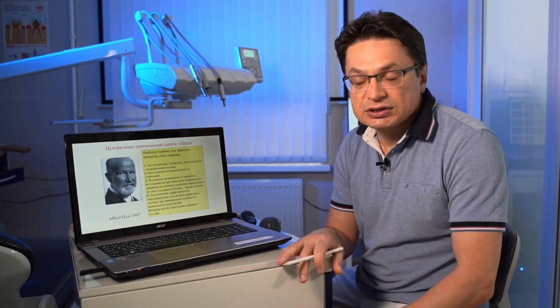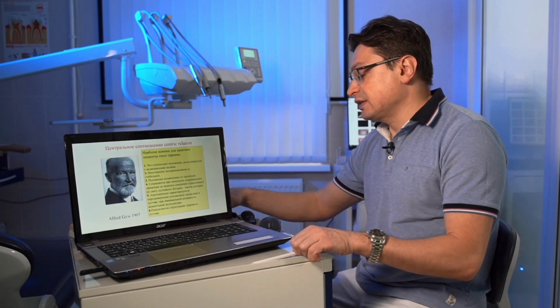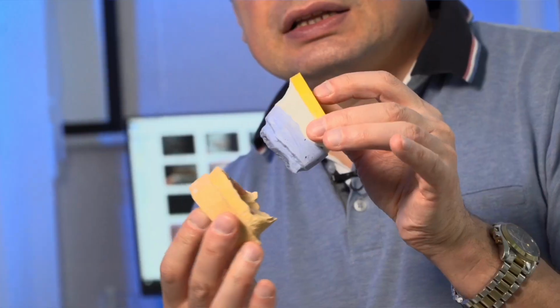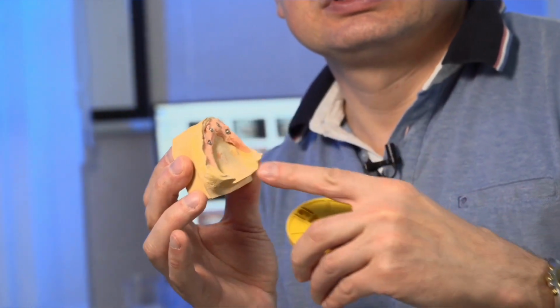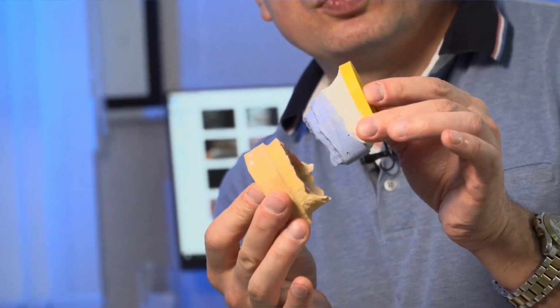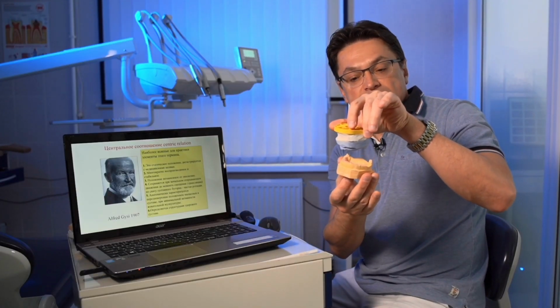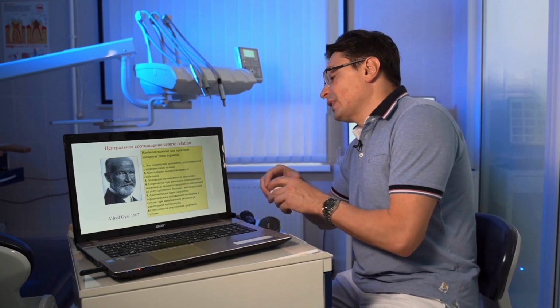So why did this problem appear? The fact is that if a patient has teeth, their models can somehow be compared and mounted on a simple gypsum articulator in which you can carry out your work. But if it is impossible to compare the models, the question about central relation appears in all its glory. When there are no teeth, you need to do some work, but the patient has no teeth. How should we compare the models? Based on what? What landmarks do we need to have?